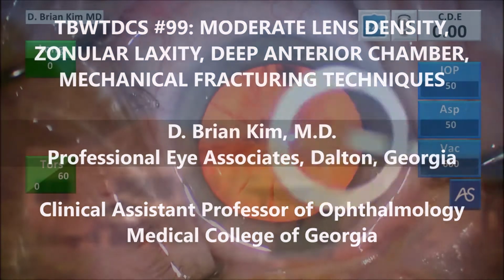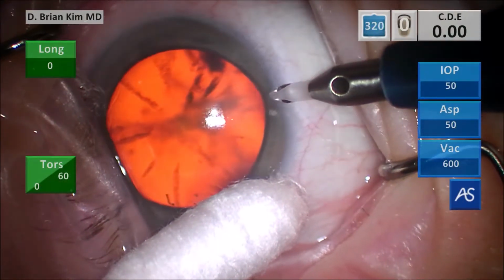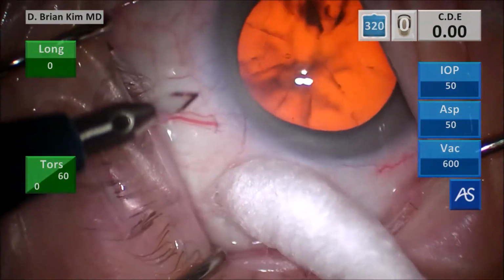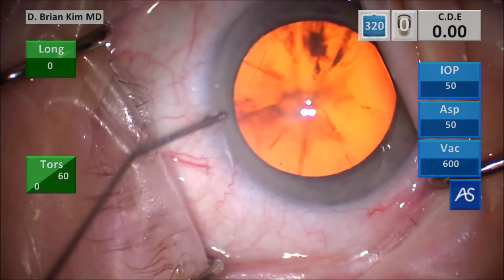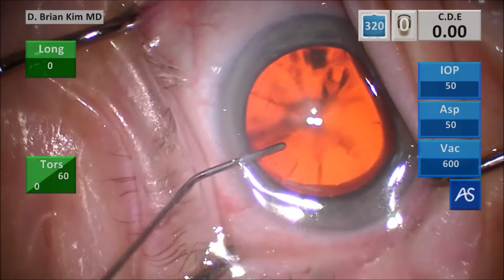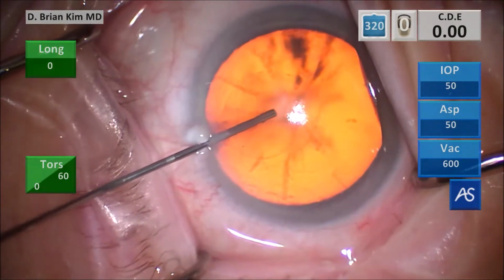I like to use a corneal marker, which will help me to center and size my rhexis. I make my paracentesis incision first on the right side and then the left side, making sure the incision is flat to the iris plane, which creates a nice corneal shelf, and it allows me to achieve a self-sealing incision. I'm injecting some intracameral lidocaine and then some dispersive viscoelastic to coat the corneal endothelium and fill the chamber.